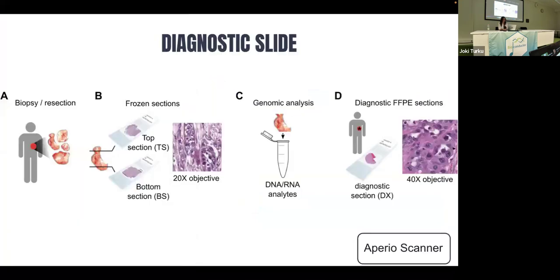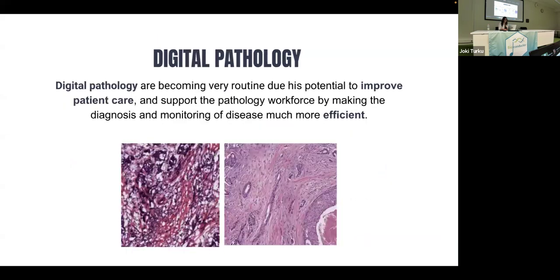These diagnostic slides are important because the resolution these images provide is the highest possible for the TCGA data, and they were used for diagnostic purposes. Also on the TCGA, other images are available at 20x resolution, but they are more used to be sure that the tumor you are analyzing is actually tumor and not just a normal sample.